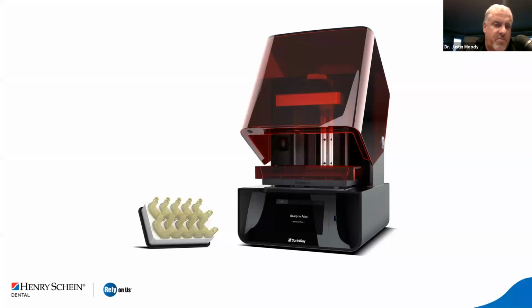But if you're just printing models, you can put multiple patients' models on a build plate, and you can get as creative as you can arranging them on there so that you can maximize the build plate on your printer.